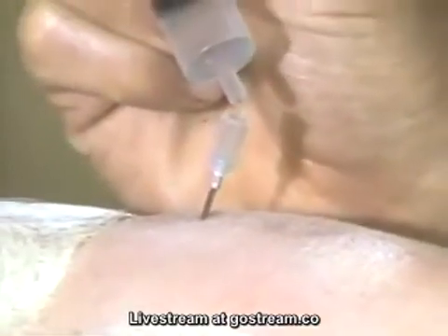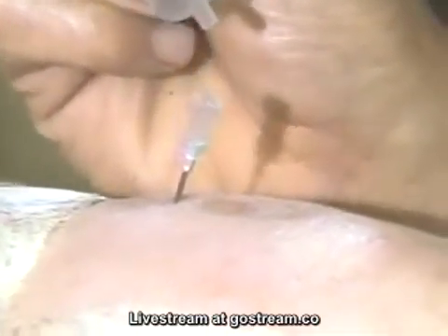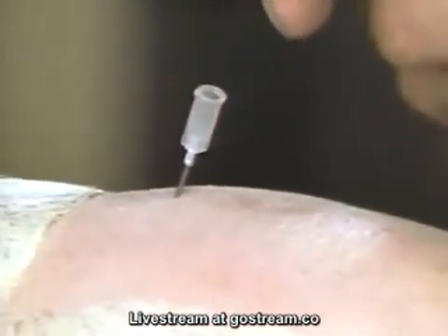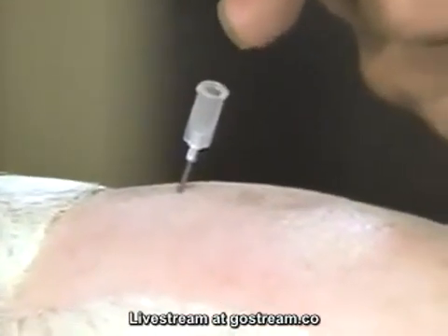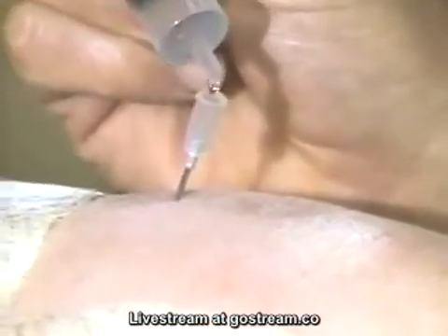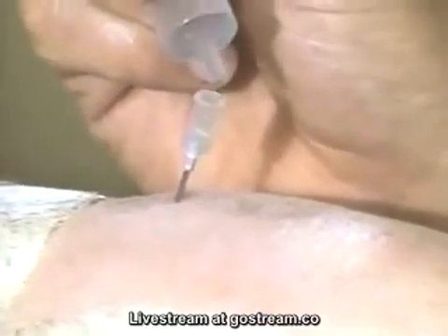One test is to put a small drop of the local anesthetic in the needle. If it pulls it in — as it did there — almost certainly there's an area with a slight vacuum, and that means it's the epidural space. There, I'm putting several drops in; they're all disappearing down into the needle. So that's the correct site.